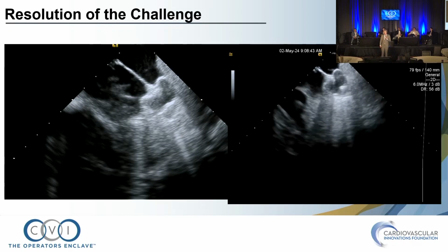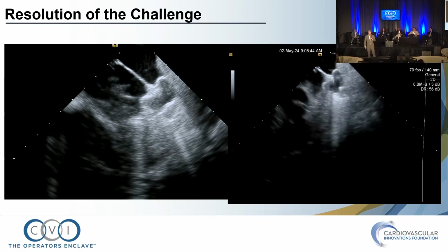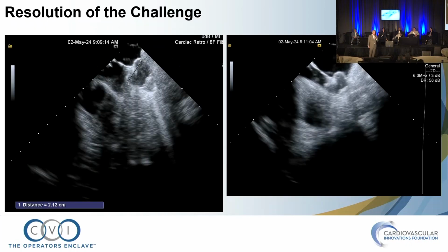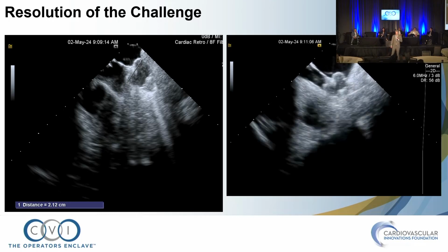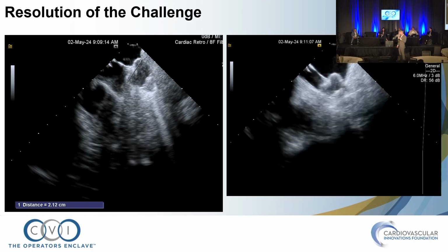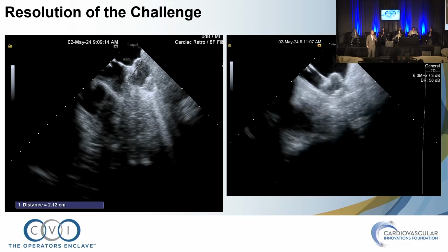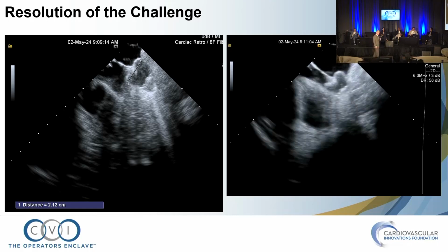The right is our aortic view. On the left is a still of the mitral view. In both views, the device is proud of the ostium, but there seems to be contact, although it's not that compressed. And I'm not sure what our compression rate was. This is a 24 device, and it was 2.1 across here. The panel on the right is our highly angulated view, the pulmonic view. And that's where you see the mitral shoulder to the right of the device really making contact right where the fabric ends.